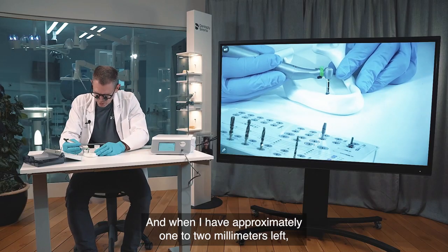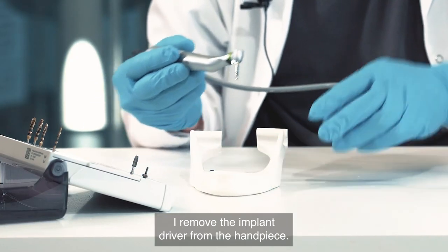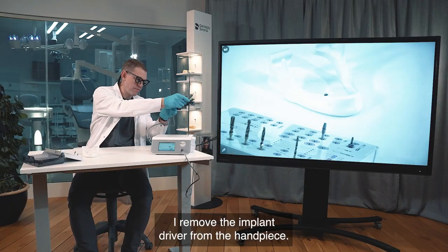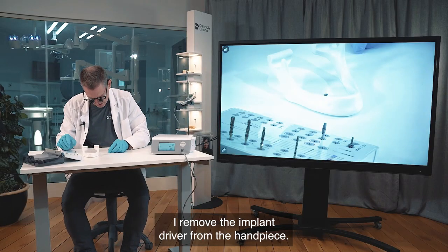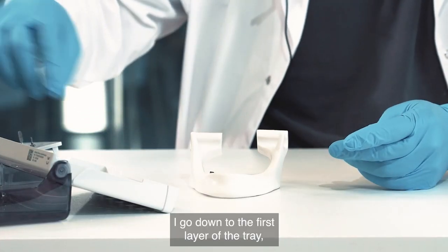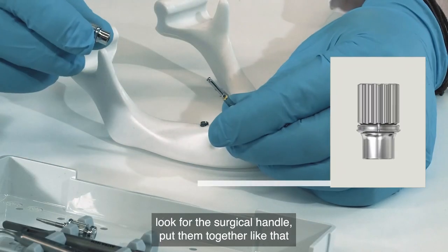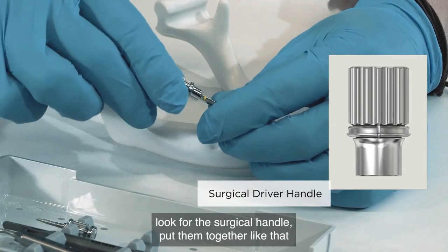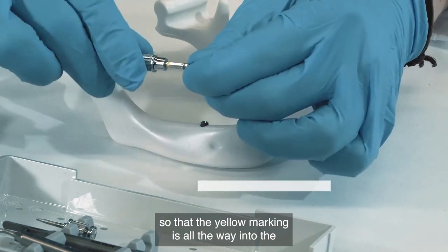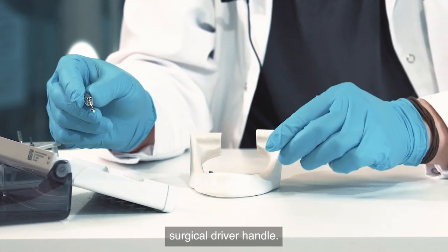When I have approximately one to two millimeters remaining, I remove the implant driver from the handpiece. I go down to the first layer of the tray and look for the surgical handle, putting them together so that the yellow marking is all the way into the surgical driver handle.